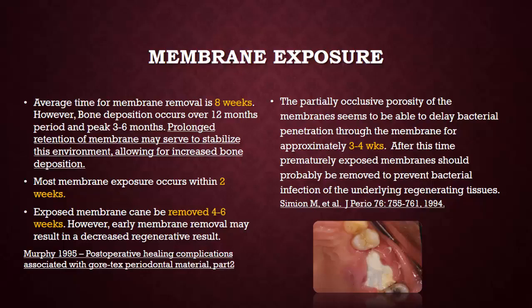فنحن الممبرين لما نستخدمه طبعا الأفضل إنه نخليه as long as we can. لما يكون مثلا الممبرين مغطى بالتشيو ما في أي مشاكل، نفضل نخلي الممبرين لحتى نعمل الري انتري اللي after 4 or 6 months healing time. لكن ممكن نحن نشيل ممبرين بعد شهرين، بعد 8 weeks. هلا غالبا اذا بده يحصل ممبرين اكسبوجر بيحصل ضمن 2 weeks من فتره الشفاء. لما يصير عندنا نحن membrane exposure, we can remove the membrane after 4 to 6 weeks but not before the 4 weeks. هلا حنشوف ليش.